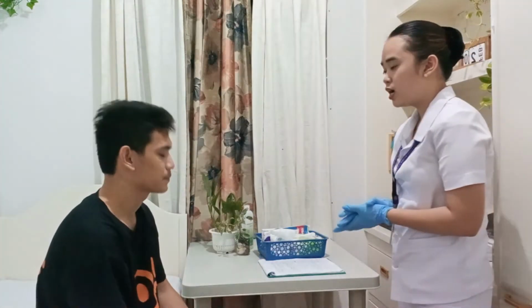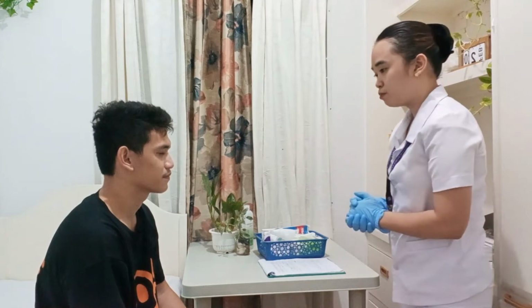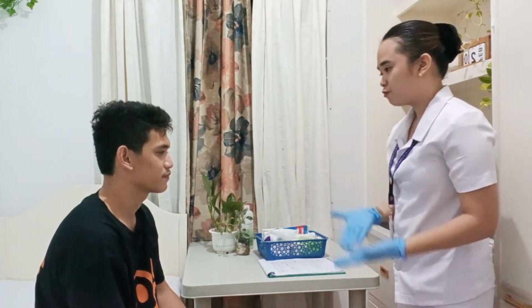Okay, Mr. Patrick, today I'm going to be assessing your body temperature, and I'm going to touch some parts of your body, and of course, there's a lot of movement that you should follow. Would that be alright? Yes, of course. Do you have any questions or clarifications before we start? None so far. Okay, that's great. Now I'm going to start assessing your body temperature.